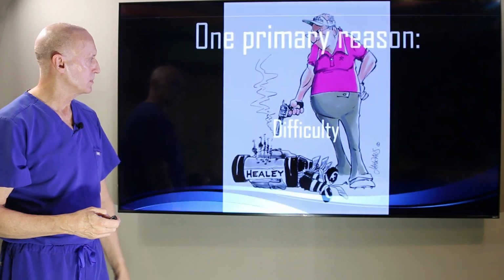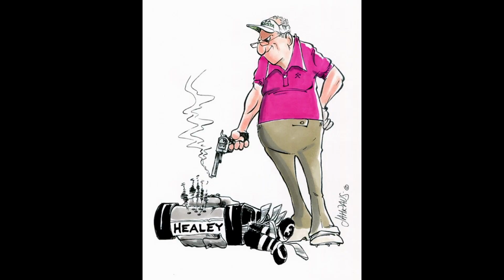So they're really difficult. And the reason I want to show this again is because there's a local colleague of mine that continues to put out videos saying that FP1s or implant bridges never turn out well because he couldn't do one on his own father.